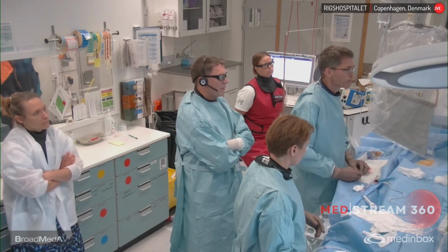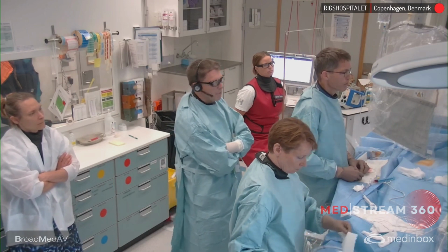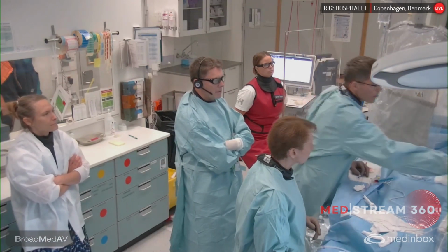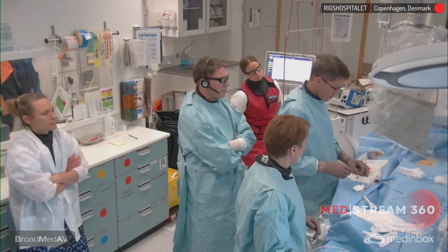He had an angio at a referring hospital, which confirmed that there was a distal left main and proximal LAD stenosis in a bifurcation with two large diagonals. And he had been on an MDT conference, and he is now scheduled for PCI of the left main.